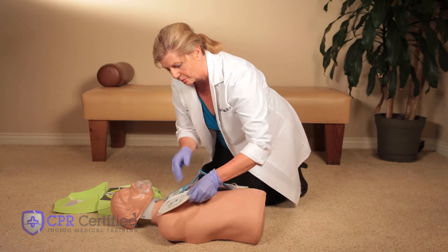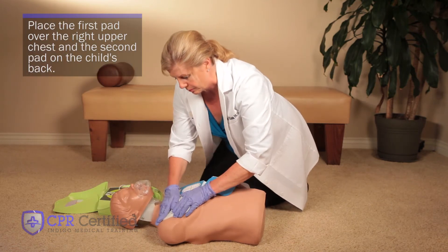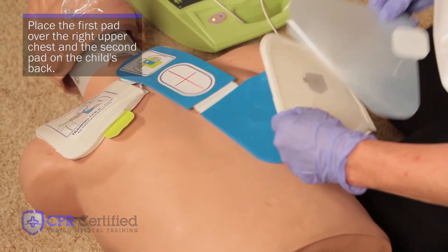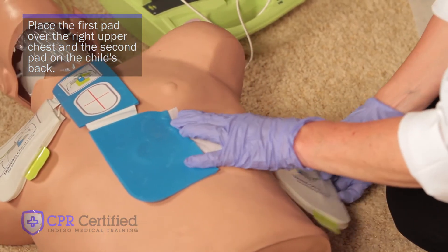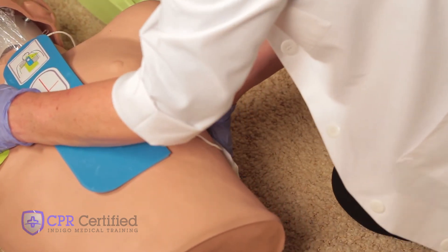If there are no pediatric pads available for your child in need, you may use the adult pads under the condition that you place the first pad over the child's right upper chest and the other pad on the child's back. The point is to allow the heart to receive an electric shock to reset its natural rhythm.